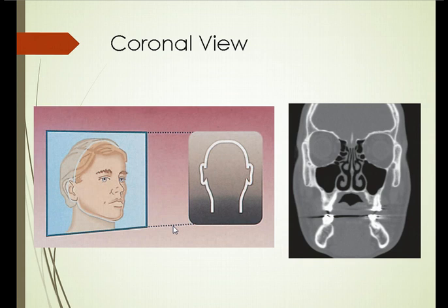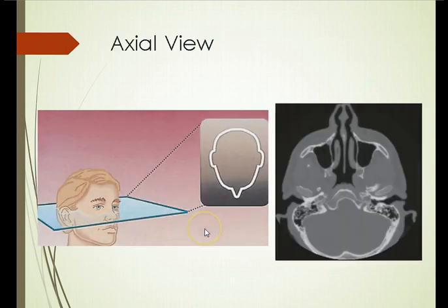The other big important part, and it goes back to our first slide, we talked about the type of bone, right? We know the length with all the tools we talked about, the width, but what about the type of bone? How can CT help us with the type of bone? I'll go into much more detail when we talk about bone physiology, but I'm going to show you the tool that we use and a little bit of understanding of how it works with a CT scan.